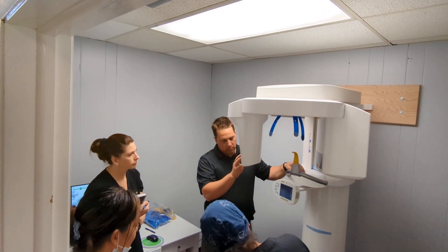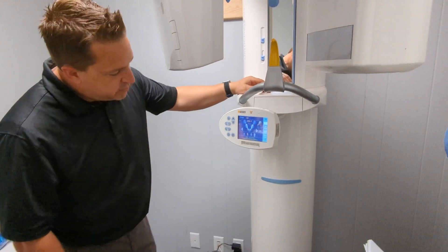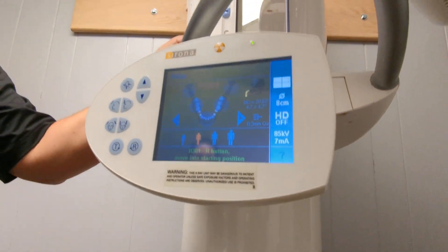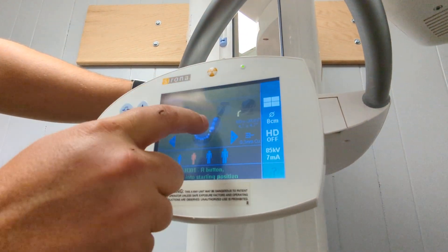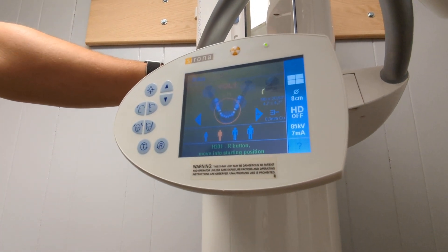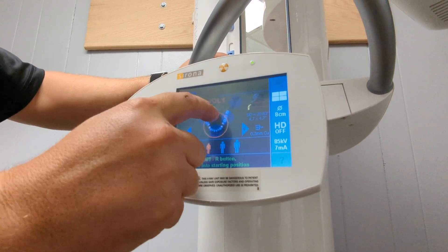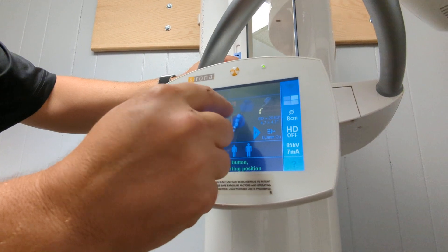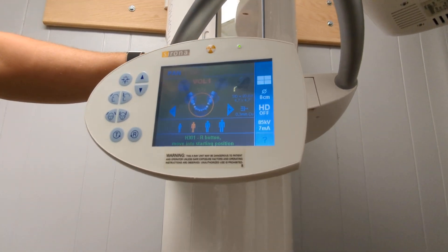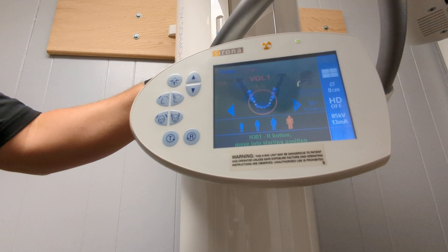This machine takes 2D and 3D. Starting with 3D — most of the time it does an 8 centimeter scan, so basically you're going to do a full arch scan. You can vary where you want to go depending on where you touch. Typically just go somewhere like that and that's going to give you your full arch. If you need more posterior you can go a little more posterior. You can do side by side, left, right, middle. It's not super intuitive but it's a very easy thing to do. Big guy, little guy buttons right here.